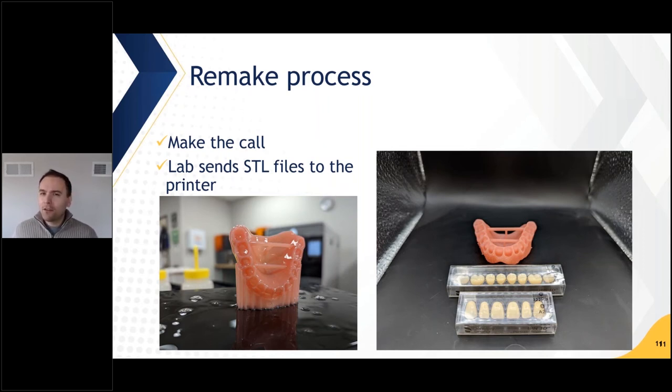Kind of like a single zirconia crown, it works the same way, but when you put it in the perspective of a denture that required so much labor before, that's a real game changer.